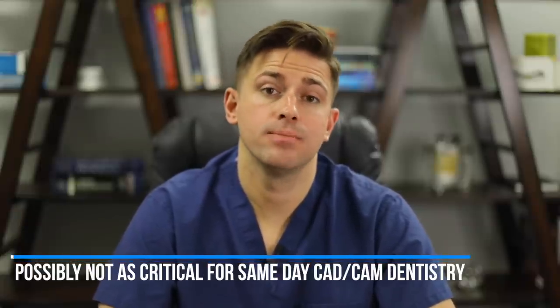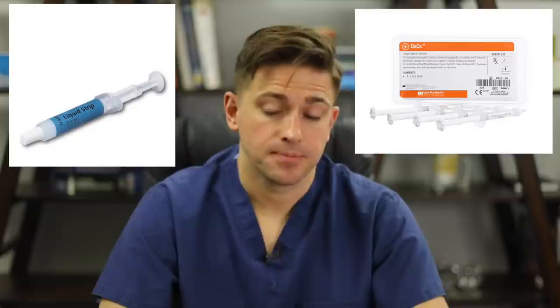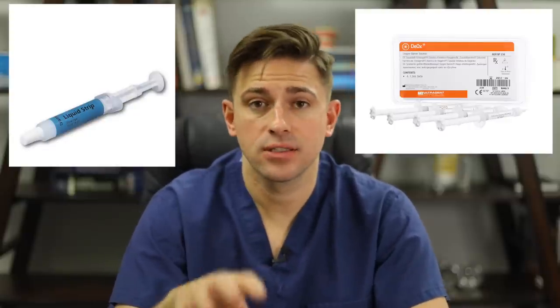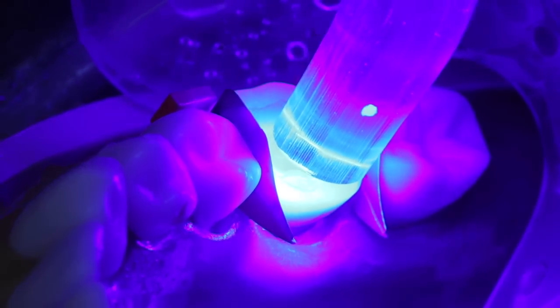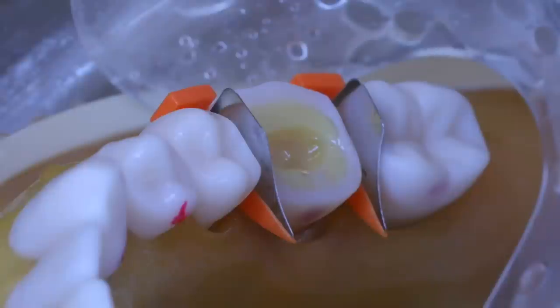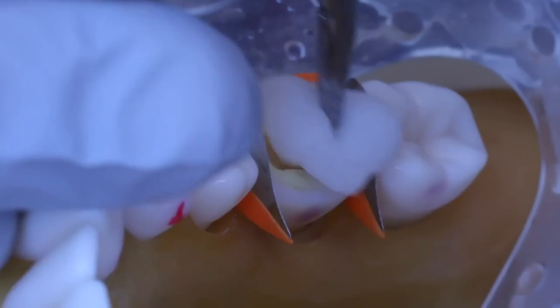The oxygen inhibition layer can be removed in multiple ways. One way is to use a glycerin gel such as Liquid Strip from Ivoclar Vivadent or Deox from Ultradent — apply it over the bonding agent or flowable composite, then re-cure for 10 seconds. Alternatively, if you don't have glycerin gel, use 70% ethyl alcohol on a cotton pellet and scrub the bonding agent or flowable composite for about 10 seconds to remove the oxygen inhibition layer.